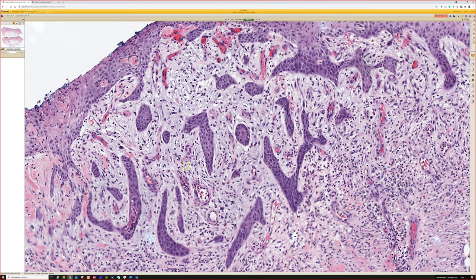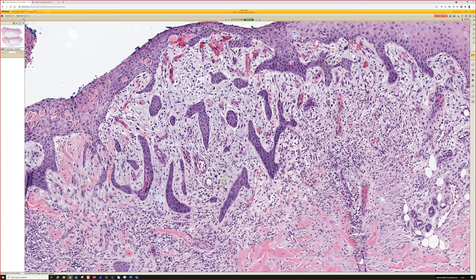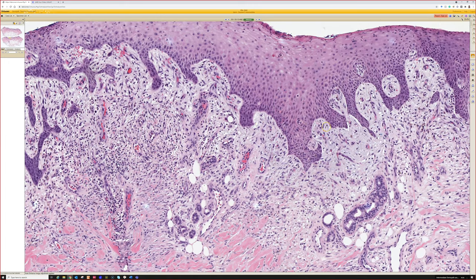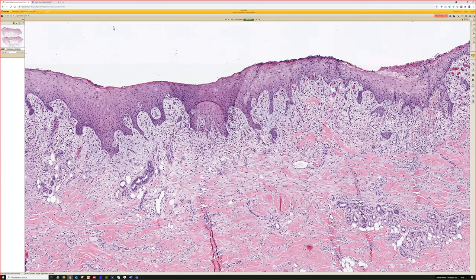This is not the most perfect example I've seen, but I think it's really important because occasionally, especially if you don't know the history, or if the patient had a history of squamous cell carcinoma and now you're seeing a rebiopsy from the scar where they're wondering, is this inflamed scar or recurrence of cancer? It can become a problem where you really worry, are these reactive or are these cancer? So it's really important to study biopsy site reactive changes whenever you get a chance to, because that will help you when you have a challenging case. And I've seen times where people really struggled and misinterpreted this as being cancer when it's actually just a benign reactive change. So this is a good example.